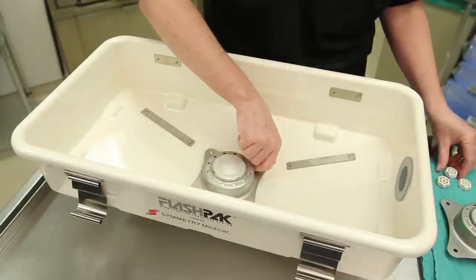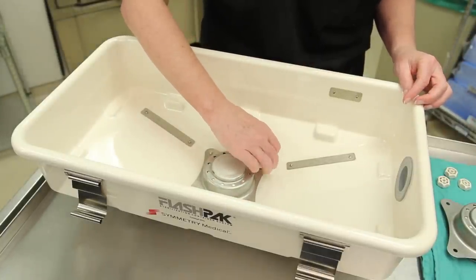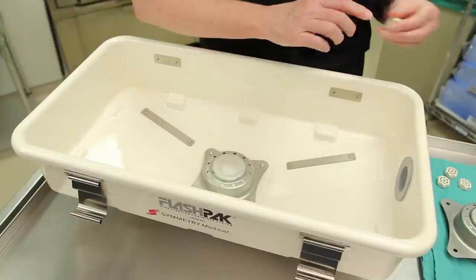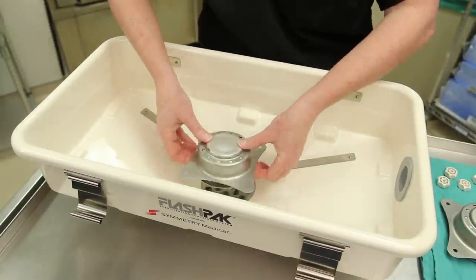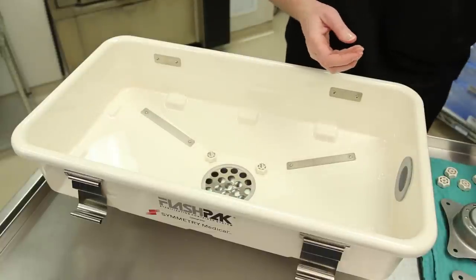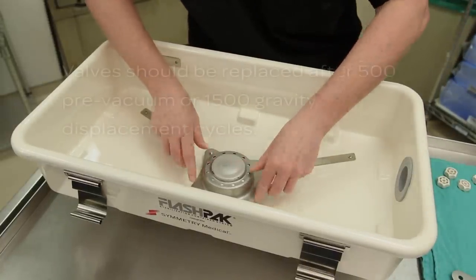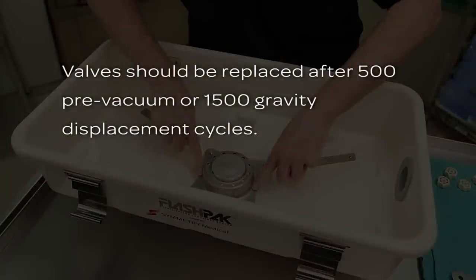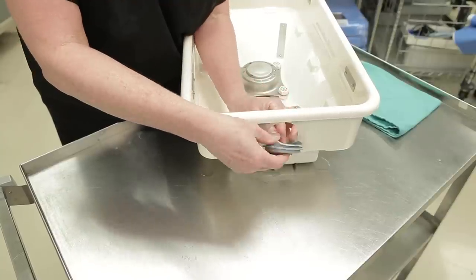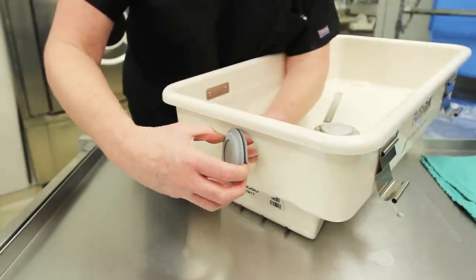To keep your FlashPak functioning properly, Symmetry Surgical recommends replacing certain disposable parts on a regular basis. Replace both valves at least once per year — both valves should be replaced at the same time. Depending upon usage, more frequent valve replacement may be needed. Valves should be replaced after 500 pre-vacuum or 1,500 gravity displacement cycles. Replace the pressure balance element at least once per year, or when it becomes rusty or discolored in appearance.